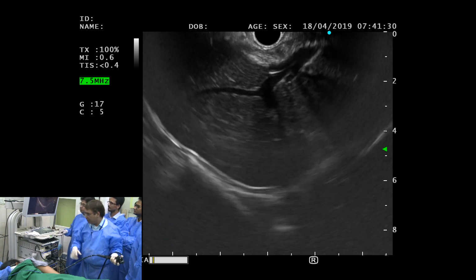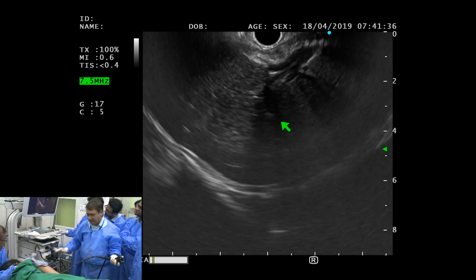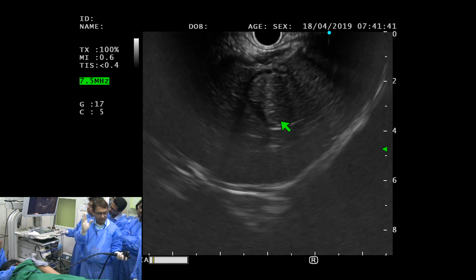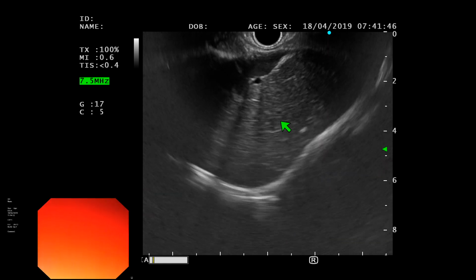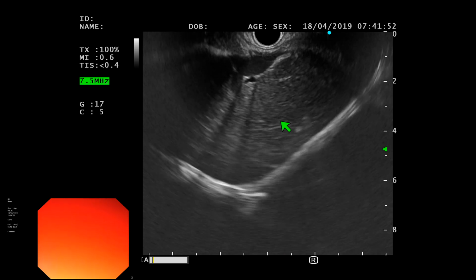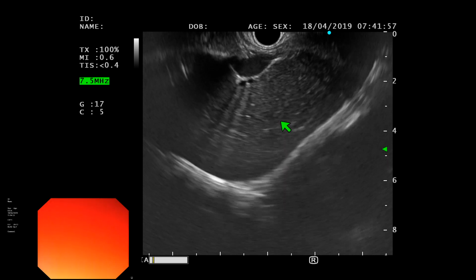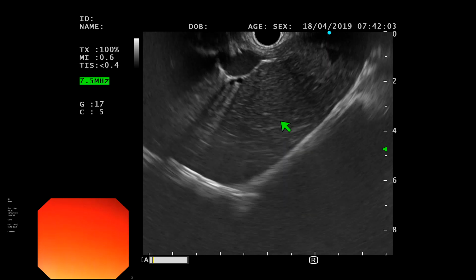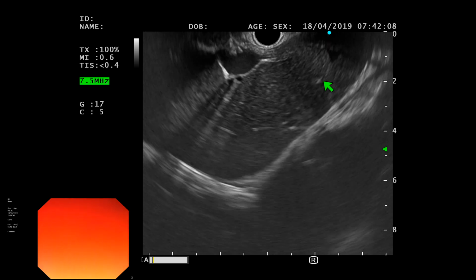So here, you look at the left lobe of the liver, and my scope is in neutral position. Again, I went to the opposite wall of the stomach. The only thing I did is move the big wheel towards me and pull the scope a little bit back, and that took me to the left lobe of the liver. From here, I'm 180 degrees, just lying flat. What I'm going to do is move the scope up to the 90 angle, and then let's see what happens. But I do that movement when 2/3 of the liver is on the left side and 1/3 of the liver is on the right side.